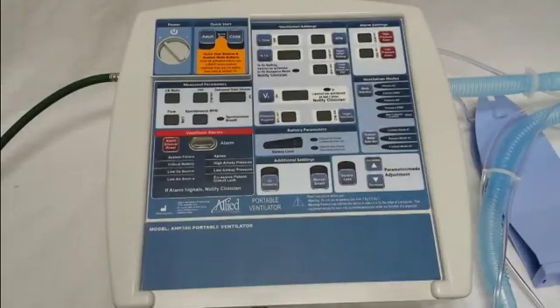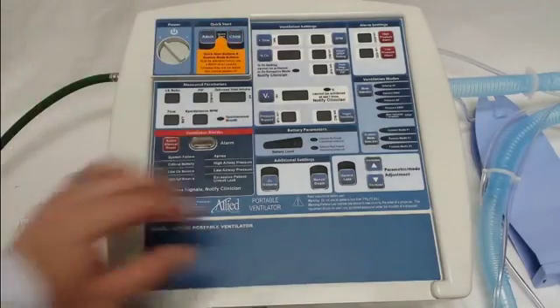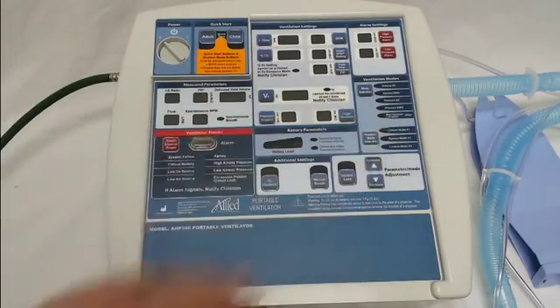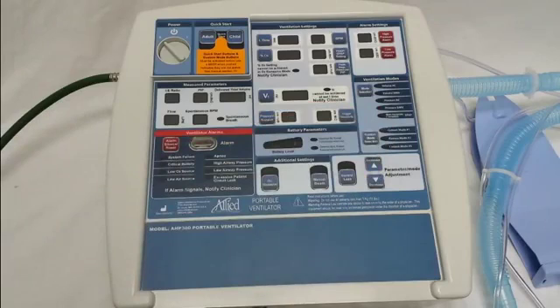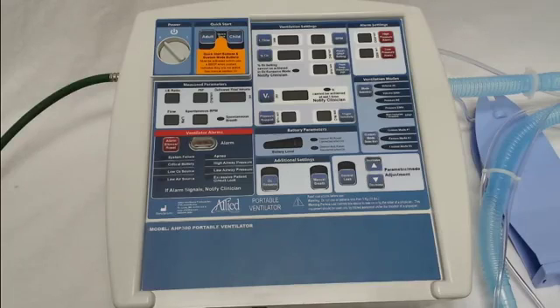This video will cover the initial programming of the adult and child quick start modes, as well as the initial programming of the custom modes on the AHP300 and the AHP300P transport ventilators from Allied Health Care Products.